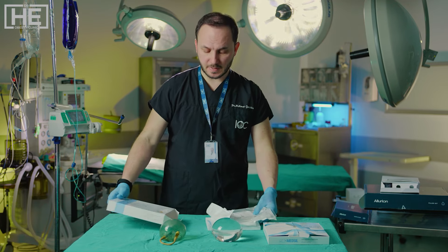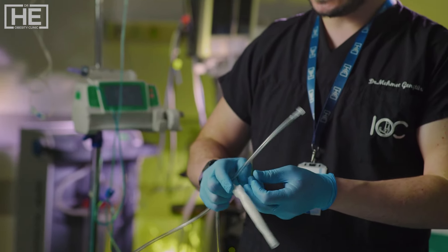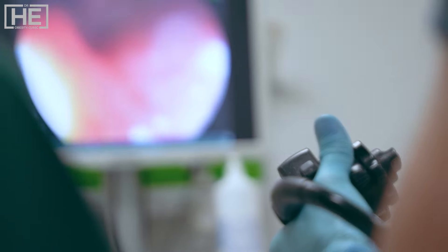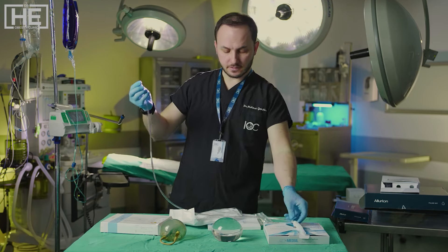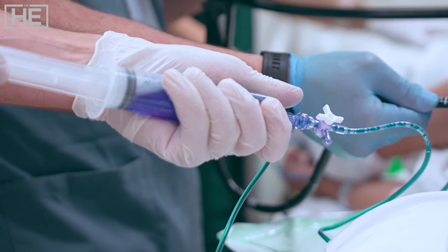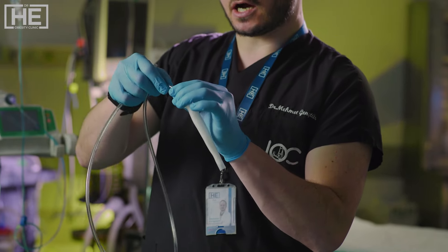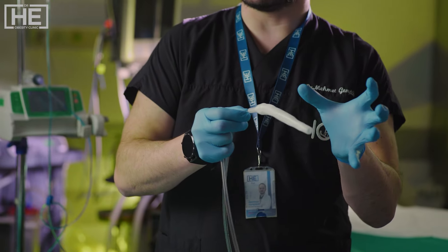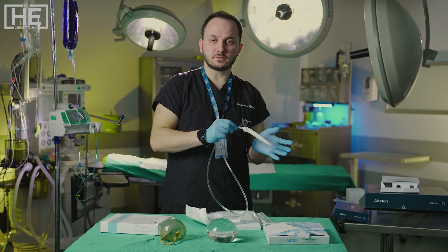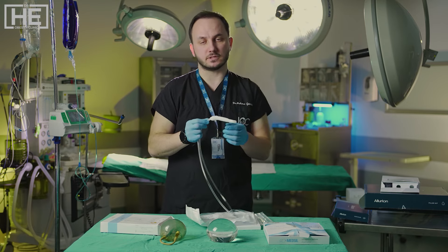Next is the Orbera one-year balloon. Same duration as Spatz-3, but it is not adjustable. However, it was the first approved balloon, and this brand has more than 300,000 balloon placements worldwide. We insert it with the endoscope, connect it with blue saline, and inflate it. After filling one third of the stomach, we cut the connection and gently remove the guide. The balloon remains inside, approximately grapefruit-sized. We can fill it 400 to 700 milliliters, but as I said, there is no adjustable option — one in, one out.